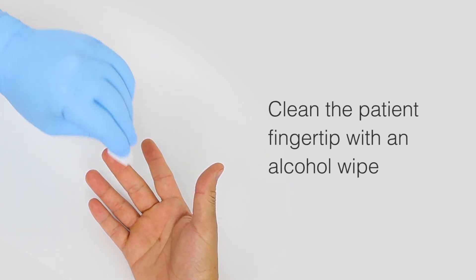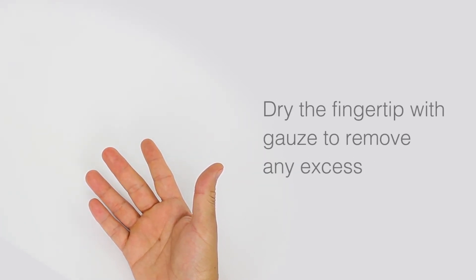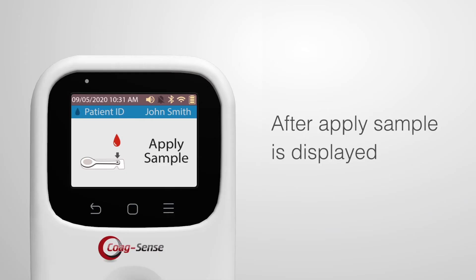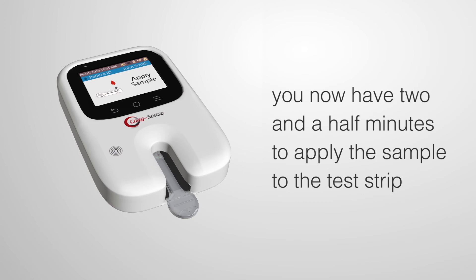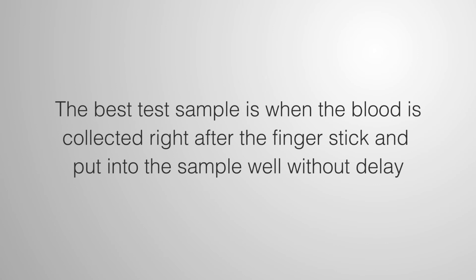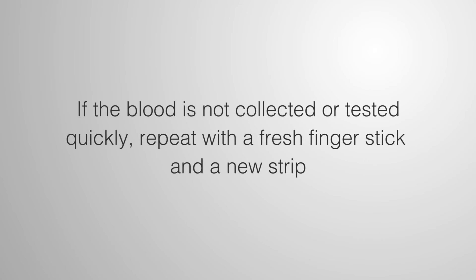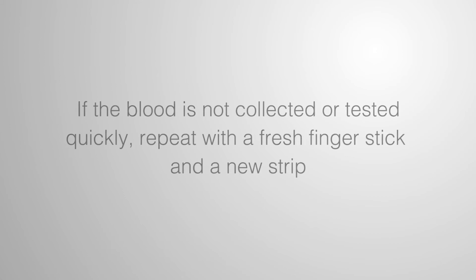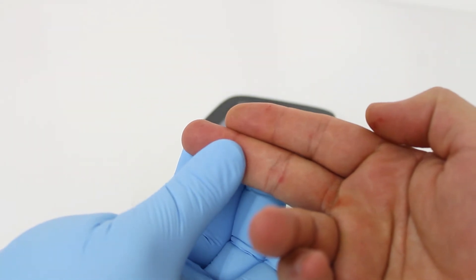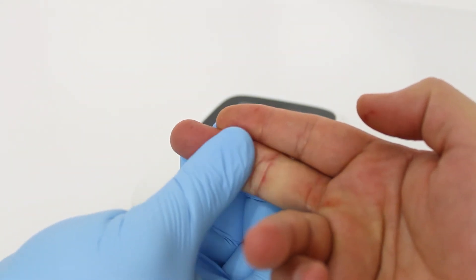Clean the patient fingertip with an alcohol wipe and dry with gauze to remove any excess. After 'Apply Sample' is displayed, you have two and a half minutes to apply the sample to the test strip. The best test sample is when blood is collected right after the finger stick and put into the sample well without delay. If blood is not collected or tested quickly, repeat with a fresh finger stick and a new strip. Use only 21-gauge lancets, as smaller diabetes lancets do not produce sufficient whole blood volume.